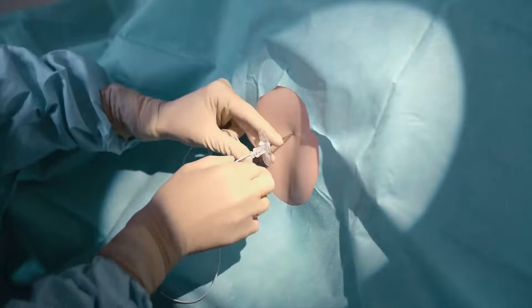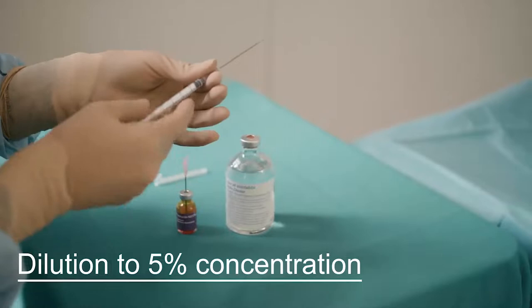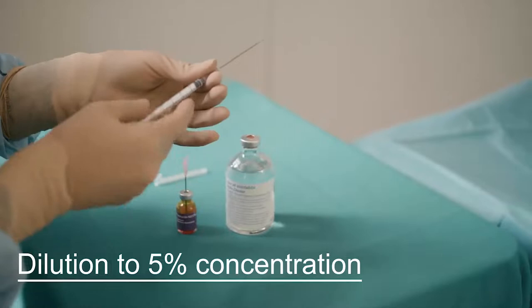Use fluorescein sodium with a 10% concentration. For lumbar application, dilute the fluorescein to a 5% concentration with aqua. Apply 0.1 milliliters of the dilution per each 10 kg body weight, with a maximum of 1 milliliter.